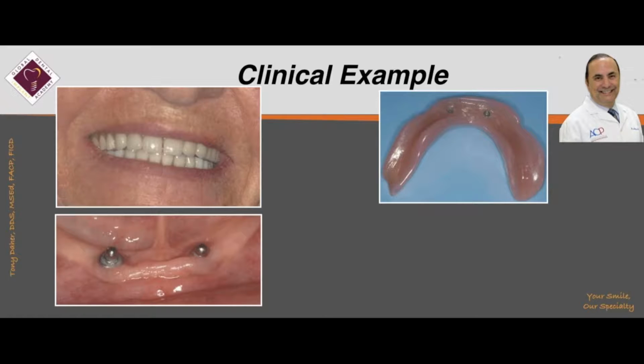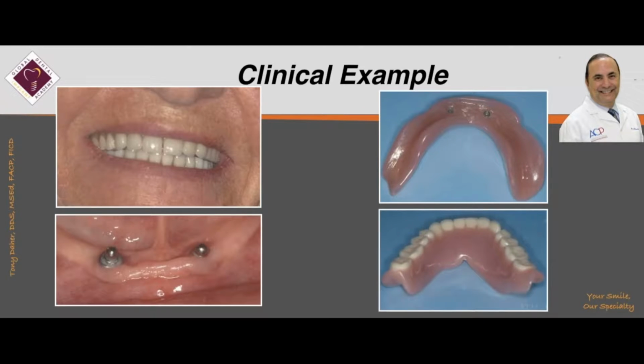The buccal shelf is made of compact bone. It does not resorb under pressure. Contrast that with alveolar bone: when the teeth are extracted and the bone is under pressure, the alveolar bone is going to disappear. And this is when you look at these flanges, and certainly there's a problem: either the anterior lingual flange is overextended, or the posterior lingual distal flange is underextended.